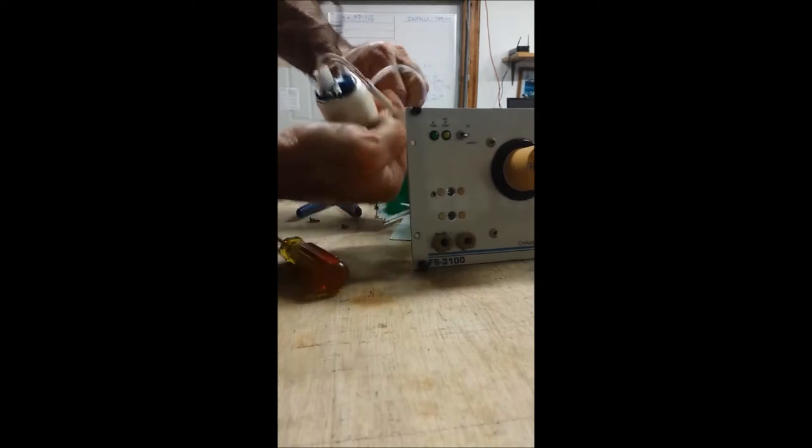Now you have this unit completely removed from the unit, and you can remove the Teflon tubing and rewrap this as you like.